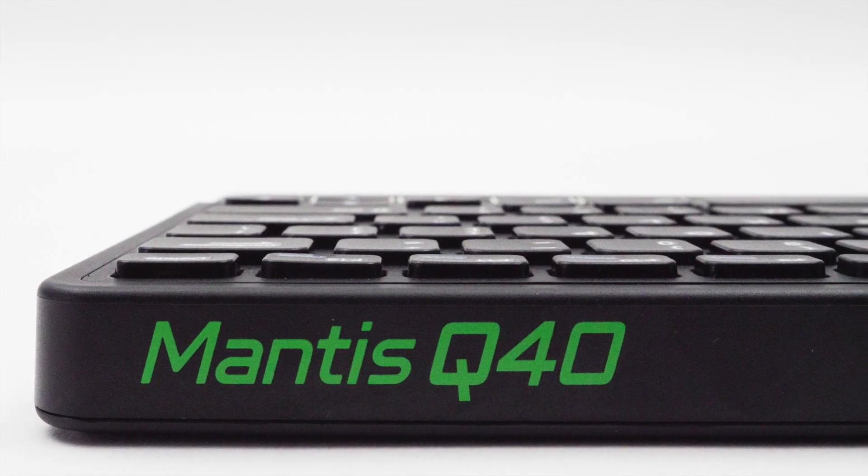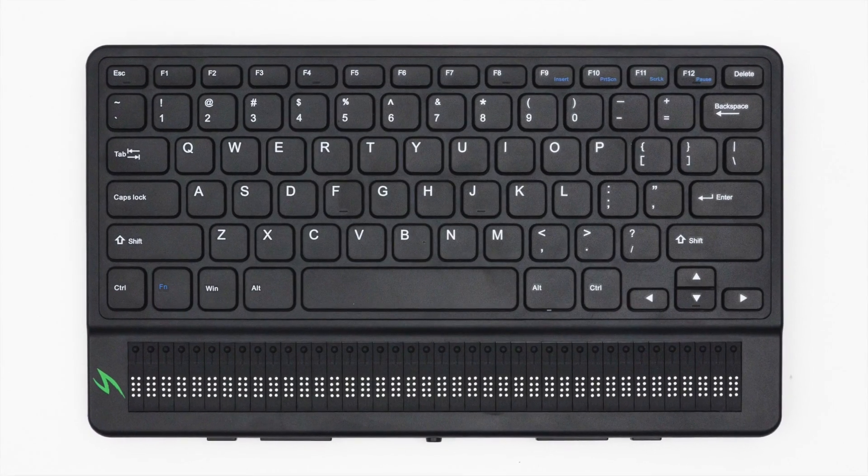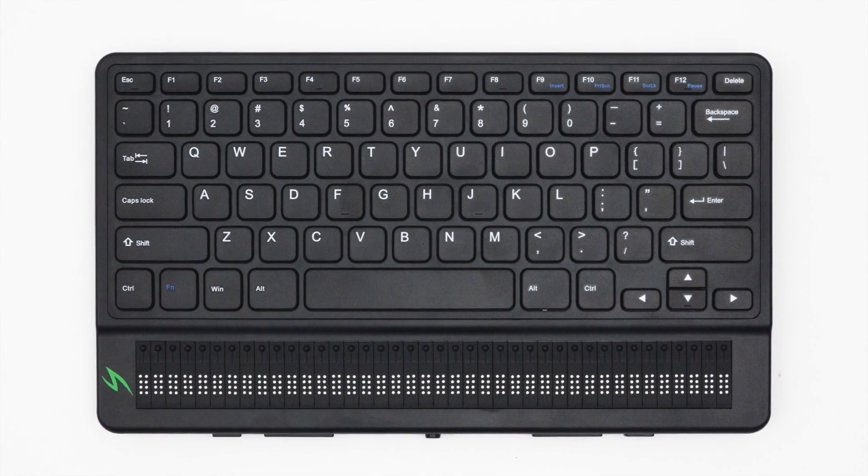The Mantis Q40 is an all-in-one QWERTY keyboard with a 40-cell Braille display, all built into one device. The goal of the Mantis is so that you can take this full QWERTY keyboard and always keep Braille at your fingertips.